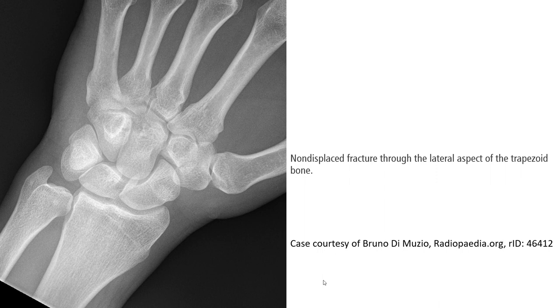And this wrist X-ray shows a non-displaced trapezoid fracture. As we can see, there is a faint, subtle lucency line across the lateral aspect of the trapezoid on this region.